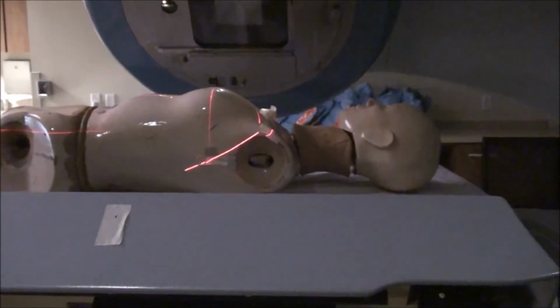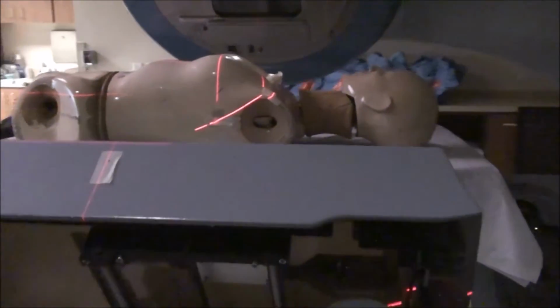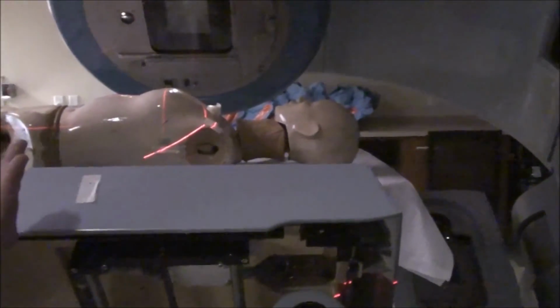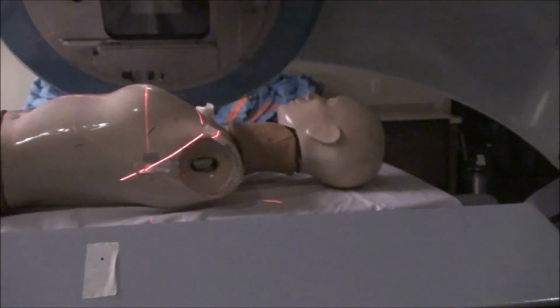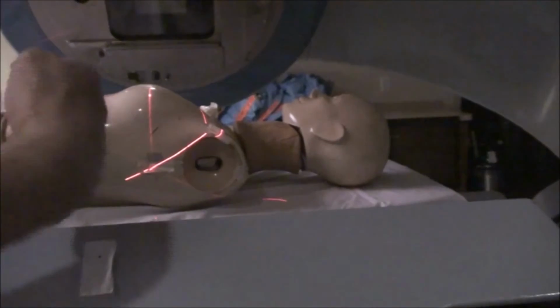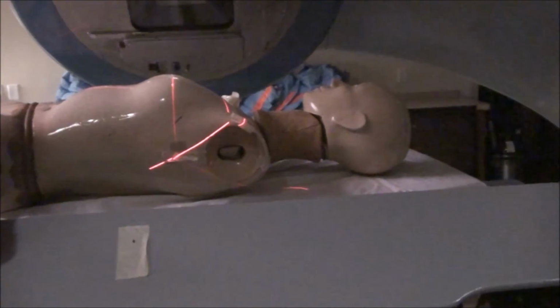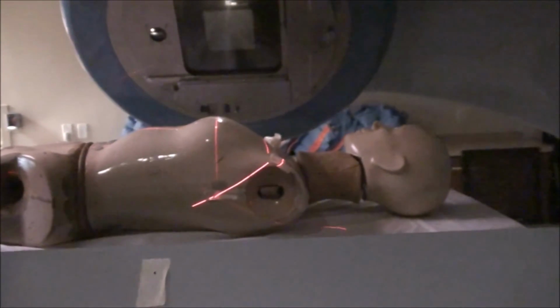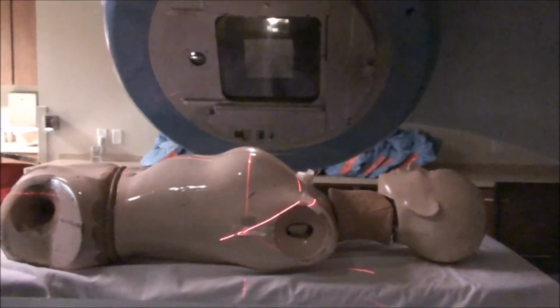We would do all our normal stuff that we did before. We were just matching to that wire. Now, all the wire is doing is demonstrating where that match line was. We're not trying to kick it until we are overlapping. We can actually see the divergence straight across here. You're actually just eyeballing it, and then you're going to show the wire versus the top of the field are overlapped on one another. You may have to kick the table a half degree one way or the other. Eyeballing it versus looking at it radiographically are two different things. So you want that wire and the superior edge of your field to line up radiographically. When you look at it on fluoro, you may have to kick the table a little bit one way or the other. But that match line will now be established.